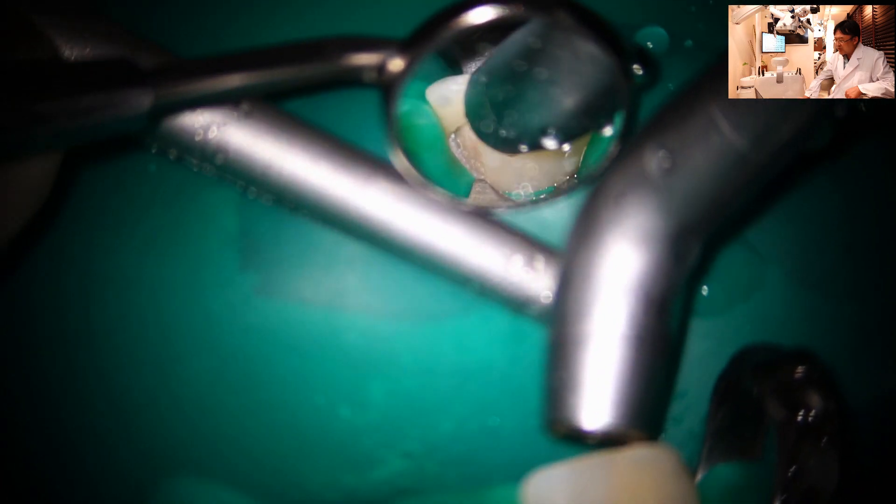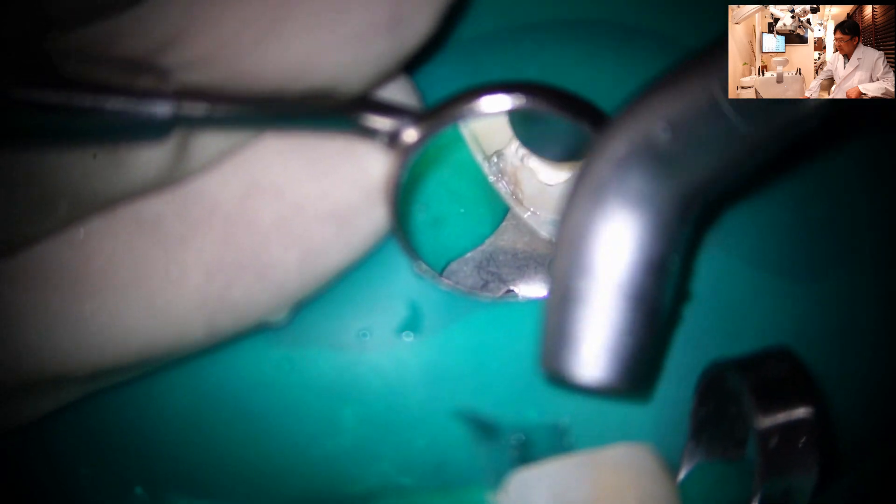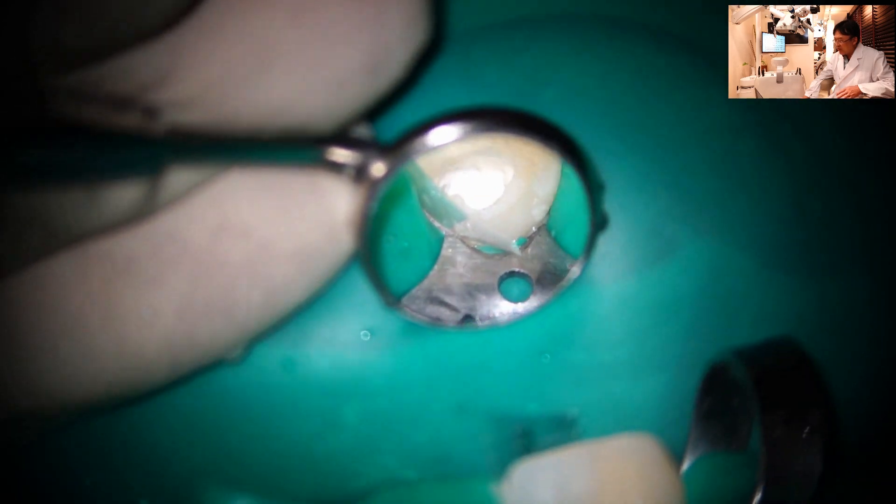And I'm rinsing the cavity with water and drying the cavity.